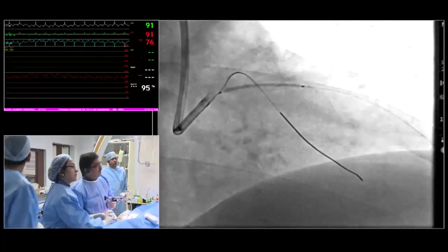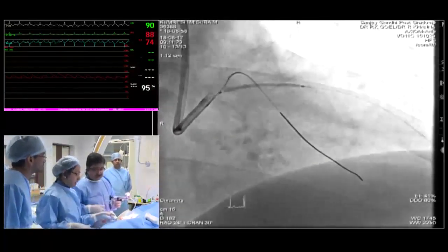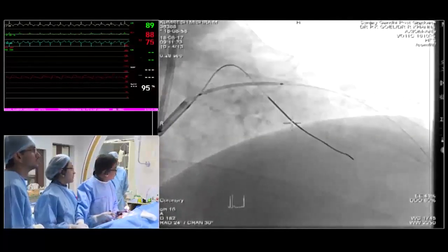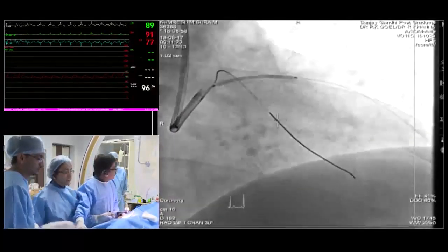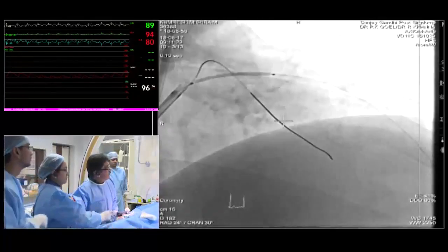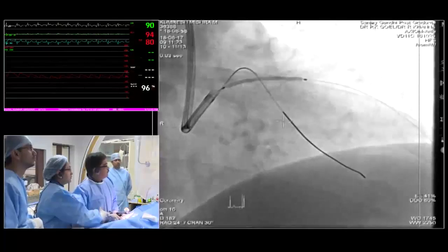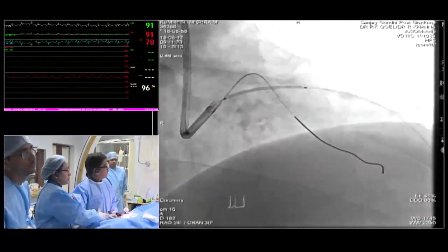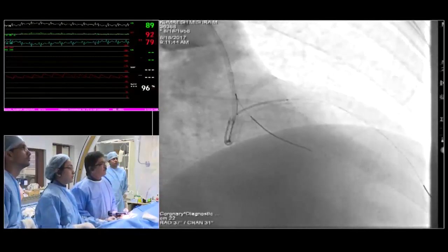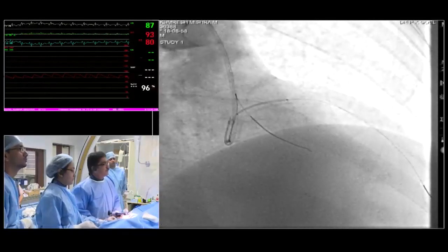Yeah. I will see. So this is the biplane. Just a sec. Okay. Oh, you check here. What have you done? Nothing, sir. The lesion stent, if it is mild, sometimes it tends to milk out into the other segments. It's better to come proximally, cover it well.